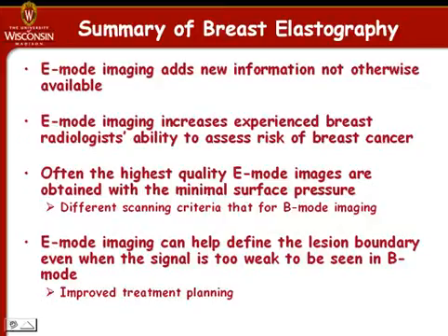We also know from this study and our practice on a number of human subjects that the method for obtaining a high-quality elasticity image is not necessarily the same as it is to obtain a high-quality B-mode image. High-quality elasticity images are typically obtained with minimum surface pressure, transducer just barely in contact with the skin surface, not pressing hard enough to flatten the tissue layers out. We also know from that work that elasticity image information can help us to better define the size and shape of a lesion, which should improve treatment planning.